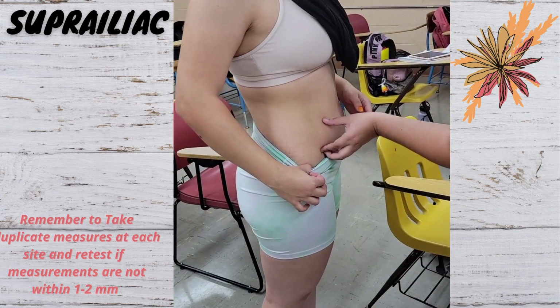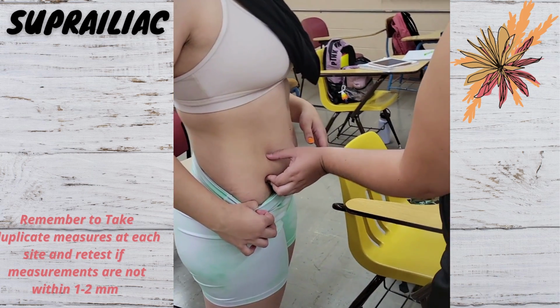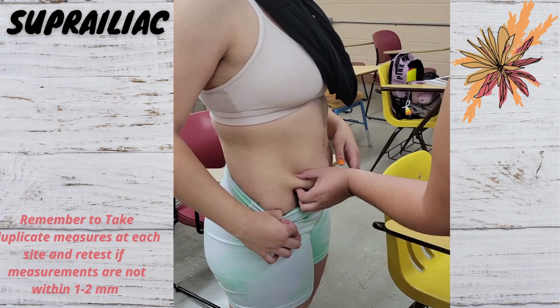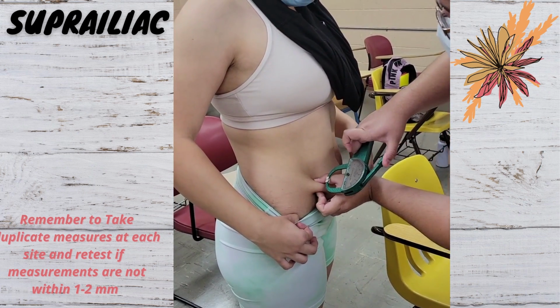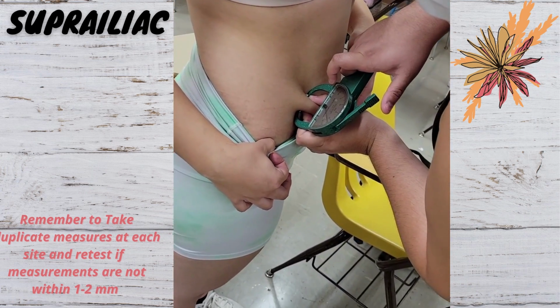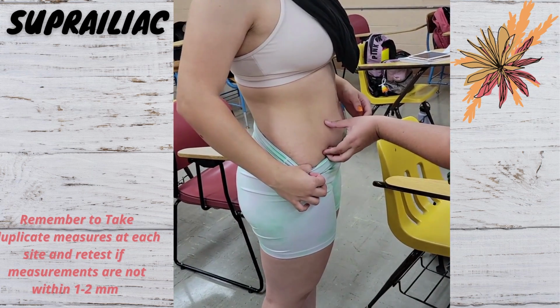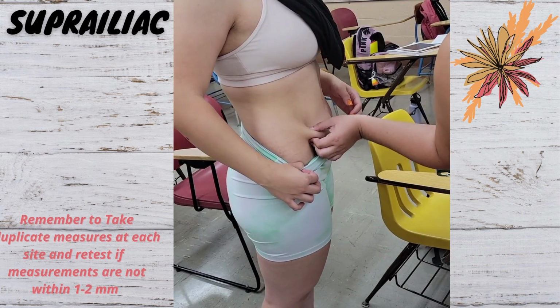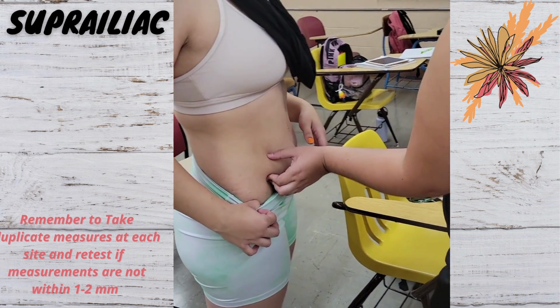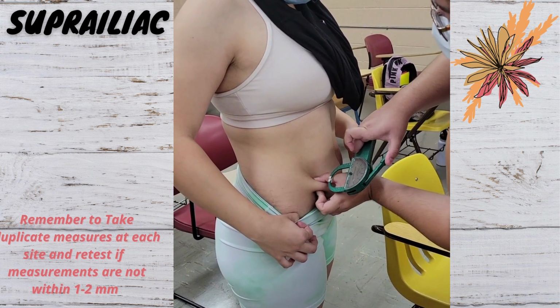When taking the right suprailiac measurement, you're going to pinch a diagonal fold just above the front protrusion of the hip bone, or iliac crest. Use the skinfold calipers directly on the skin, but remember to be perpendicular to the diagonal fold. Maintain the pinch for 1 to 2 seconds, then record your measurement.